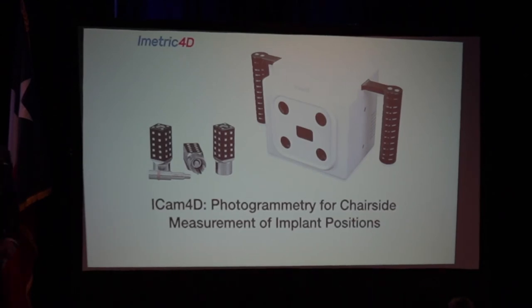What changed is they didn't take a full course and harp on the intraoral scanning strategies. I talk about it for a couple hours in my course because there are just so many errors that I see dentists doing day in and day out. It's just because the technology is new and the reps honestly don't know how to train on all the little things that can go wrong. But what changed is the scanning strategy for the dentist. So if you ever get a crown back, it's 95% of the time your intraoral scan or the impression was off, and that's why the lab was off.